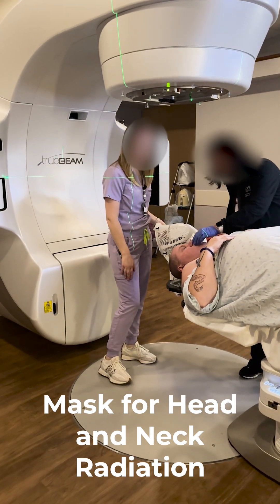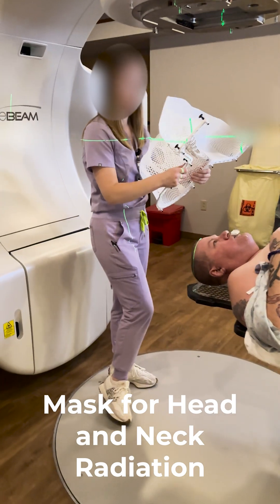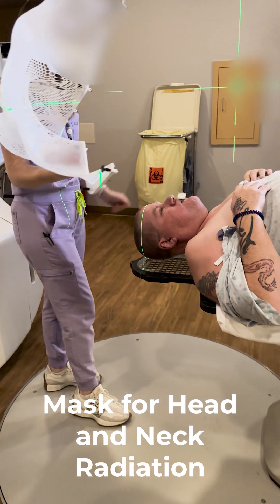This is how they place the mask when you're going to get head and neck radiation, to hold you in place for very precise targeting of the radiation.